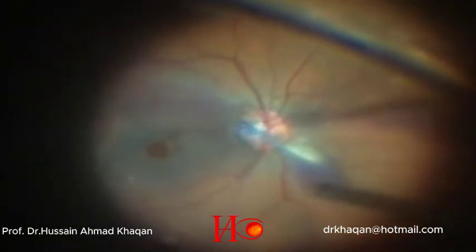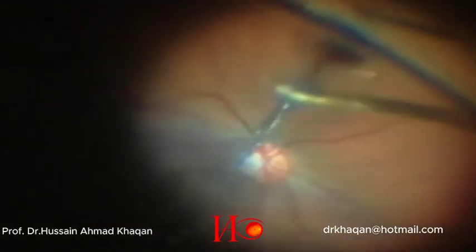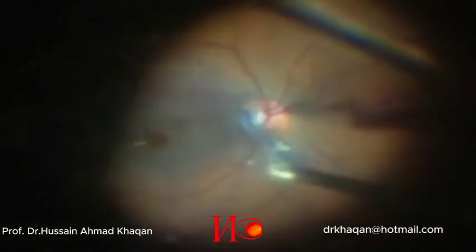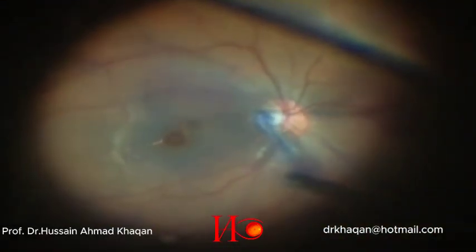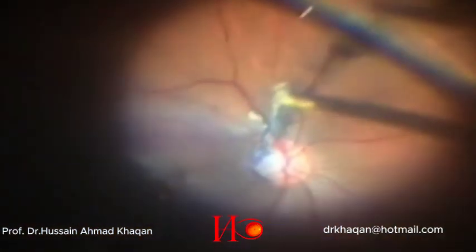Here you can see a thread-like tissue of vitreous that has plugged the optic disc pit. I am trying to pull it out, but it is not coming out. As it is very strong, I decided to just trim it and not to plug the pit with a punctal plug.